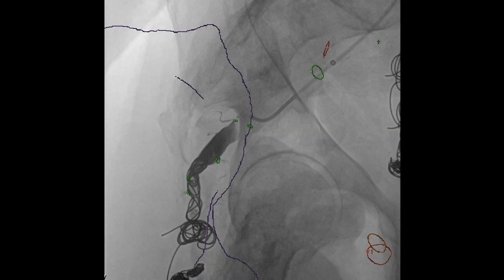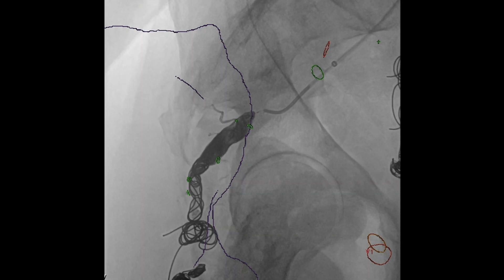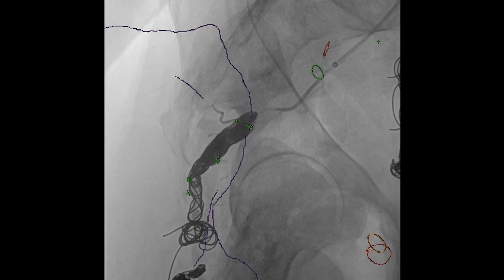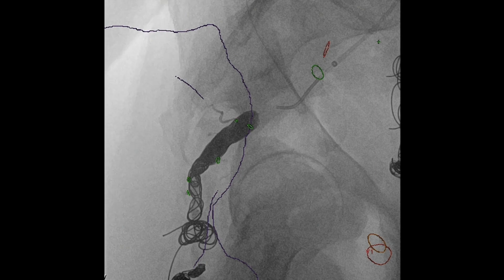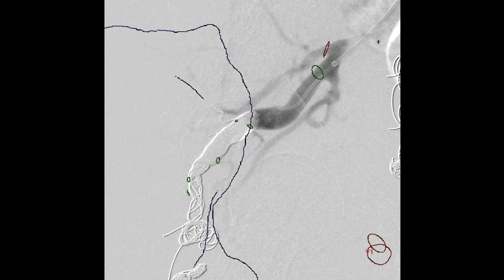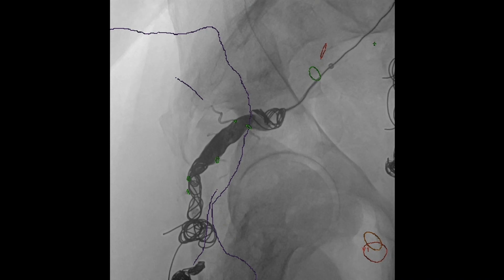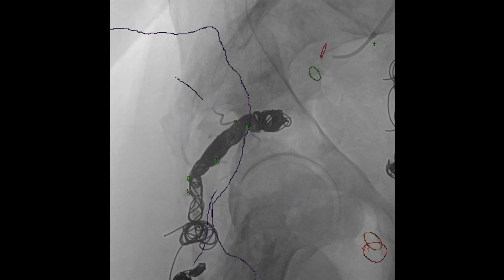Here we placed a coil near the origin to back it up, with a little more onyx. What you're always watching for is that it's often the last coil or last onyx injection that gets you in trouble as it comes close to the origin of the target vessels. We got this fairly well occluded and chose to put in one more coil to complete the plug — coils distally, onyx to take out the side branches, then one final coil.